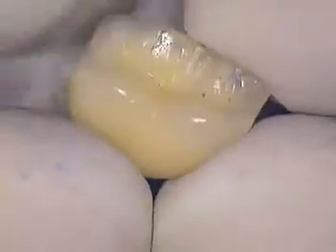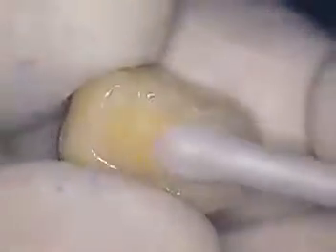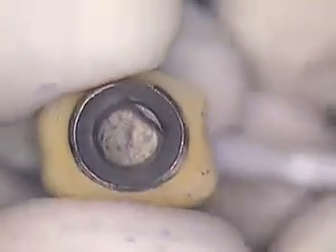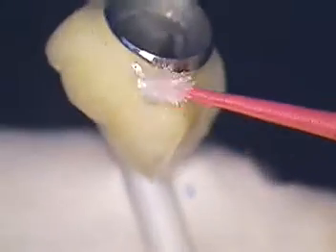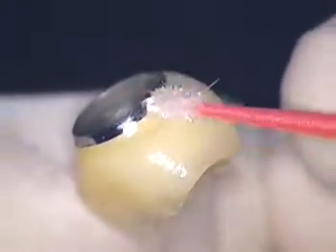A little bit about contour as well. We're going to use something called a pick-and-stick, so we'll be able to control this via the occlusal portion. It's sticky with a little wax on the end and a little stick — you could probably make these yourself; it costs about 45 cents each. Here's the inside of our implant crown getting ready to be cemented in. First thing we're going to do is paint a lubricant. I'm going to use a micro brush with some normal household lubricant, painting it around 360 degrees all the way around, in through the contact, to the facial aspect, distal aspect, everywhere. Be very careful not to get this on the margin.